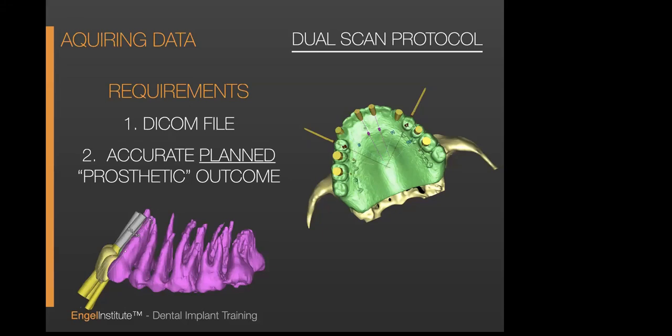This is the demon that is after you in surgery. So if you remember just a few things through this whole lecture, this is definitely one of them. You must know where you're going to end before you start. Everything is predicated on incisal edges and tooth position. Now, the second file is something that we refer to as an STL file, which we'll get into.